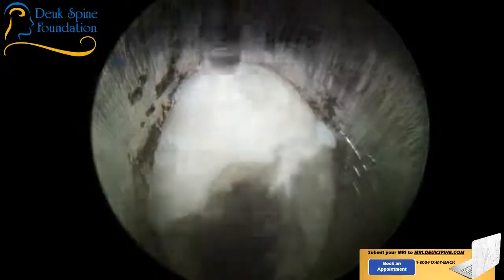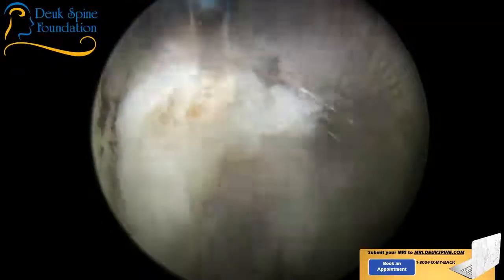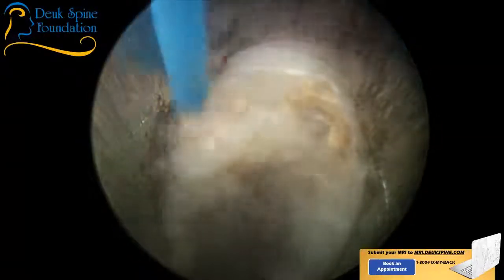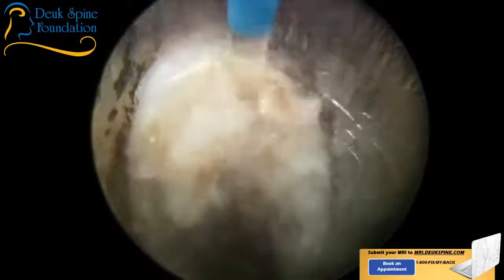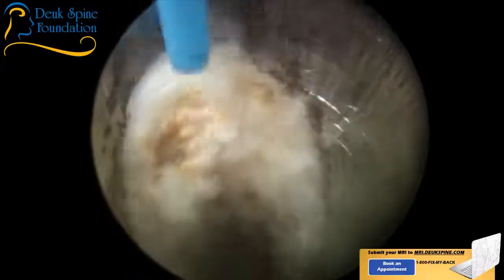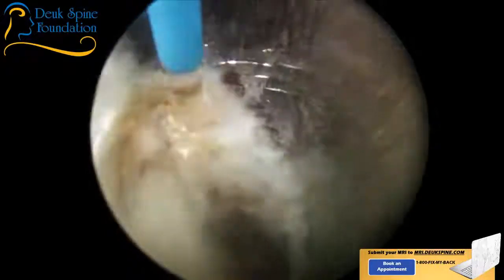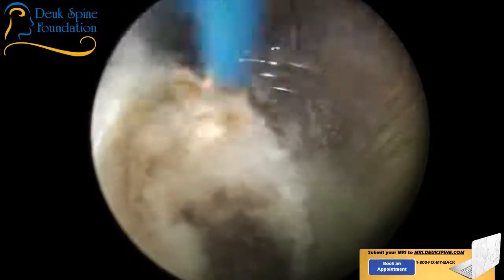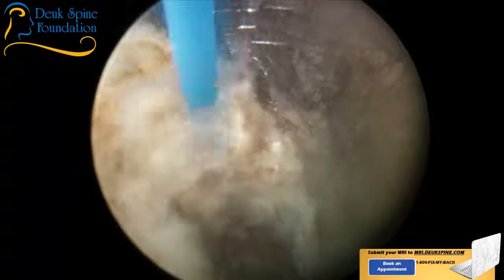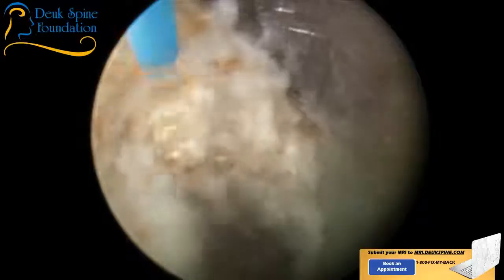So here's part of that tear right there. It's partially healed. You can see scar tissue on top there. It's like a little cap of scar tissue, but it's never healed properly, and that's why she continues to have pain from this disc herniation. So by using the laser, I can get rid of this damaged tissue that's causing pain, and the body will heal and replace it with good tissue that doesn't cause pain. Really what we're doing is helping her heal her own discs by getting rid of the tissue that is keeping the disc from healing properly, using the laser.